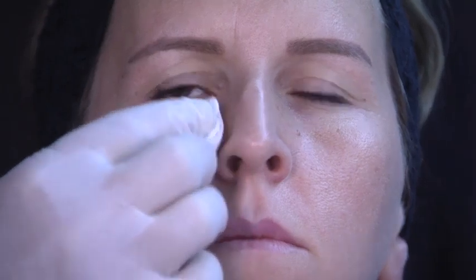Remember, the teaching point here is first treat the mid phase, then we treat the tear trough directly with the needle, completely perpendicular, and we mold the product toward the medial part. We cannot probably correct 100% of the tear trough, but this is a good thing. In the first session, try to correct 70% of that tear trough, because with the retention of water, we want to avoid any problem. So in 15 or 20 days, you can add a little bit more, and I think this is enough.